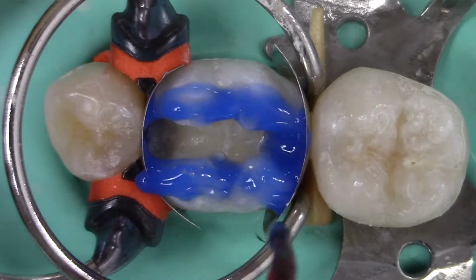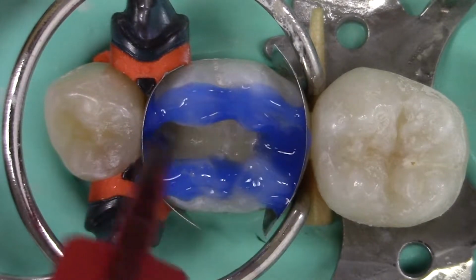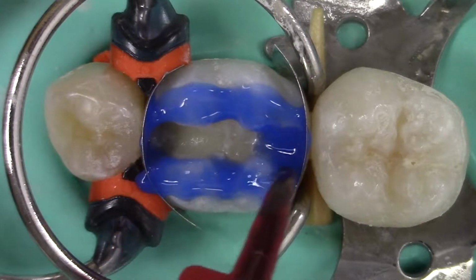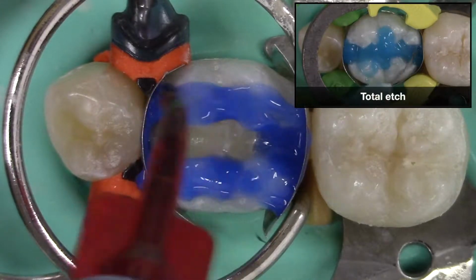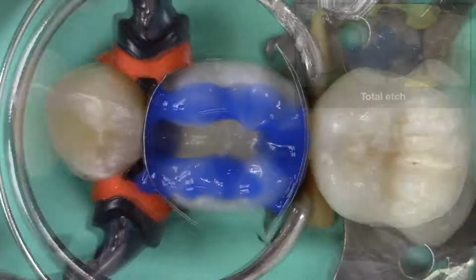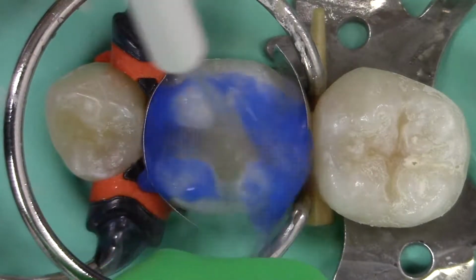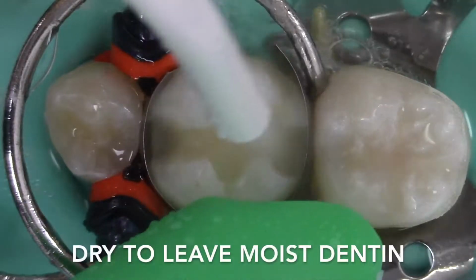The technique shown in this example is a selective etch technique, in which the etchant is applied to the enamel only for 15 seconds. If a total etch technique is used instead, the etchant would be applied to both the enamel and the dentin for 15 seconds. The etchant is completely rinsed off the tooth. The dentin is then air dried to leave a moist surface.